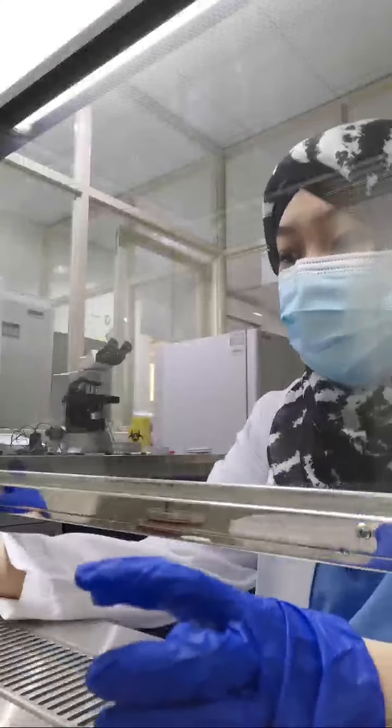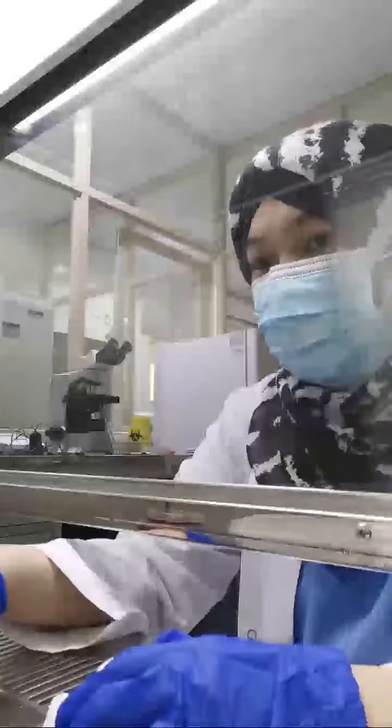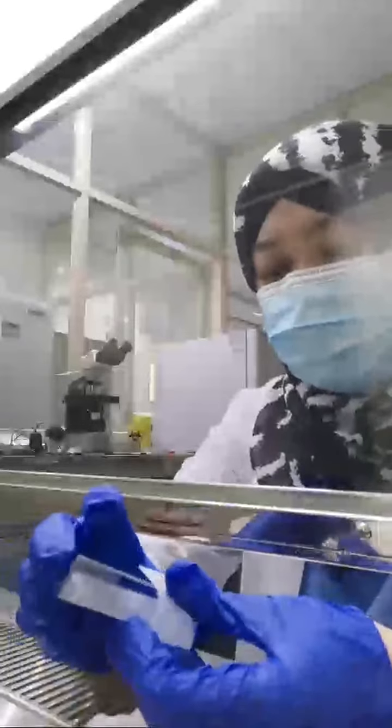For the antibiotics, we will impregnate the antibiotic discs in the agar. We will put the antibiotics in the MHA, Mueller-Hinton Agar. Susceptible or intermediate. So the antibiotic depends on the age, if it's a kid or an adult, if it's pregnant, or if it is sputum or stool, it will be different.